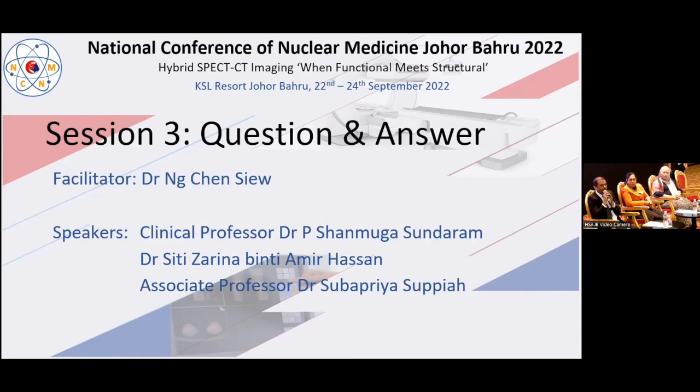Having told that, please keep it in your mind: brown tumors in severe hyperparathyroidism also will show significant sestamibi uptake, especially, obviously, in bones. So you will make the diagnosis of parathyroid carcinoma if there are uptakes in lymph nodes, lungs, and skeleton. But if you see uptake only in the skeleton, you have to be very careful. It can be simple hyperparathyroidism with brown tumors. It has to be kept in mind.